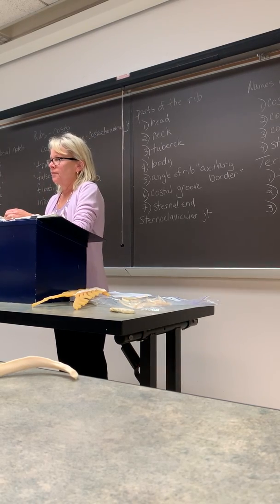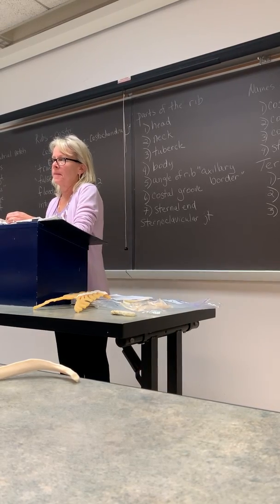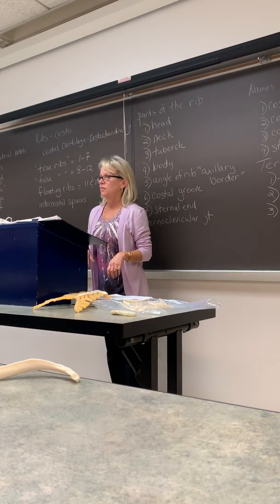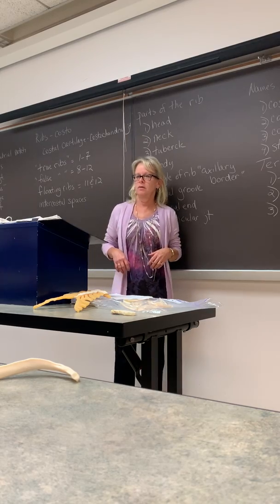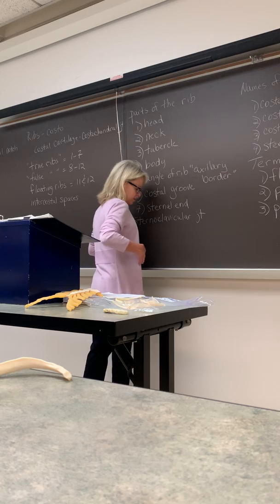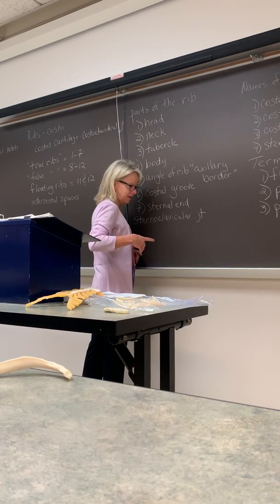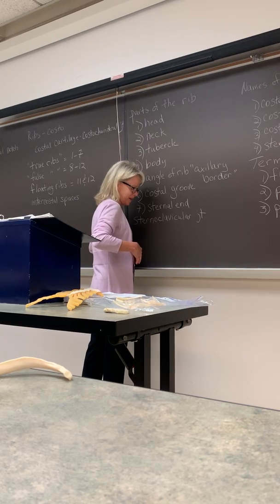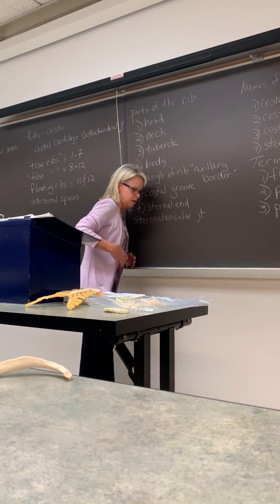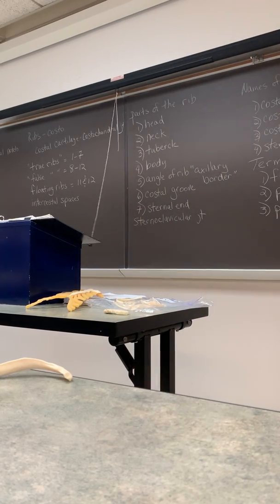Okay, so if you're AO, it's the affected side down that's elongated. So then it's the same as... You confused me. Wait a minute. Okay, so LPO, RPO is the side that's against the IR, right? Hang on, I gotta think. You should use the skeleton. Like this, okay.